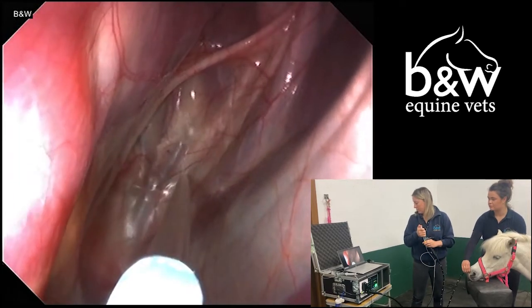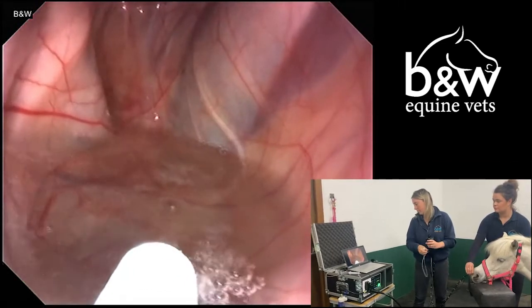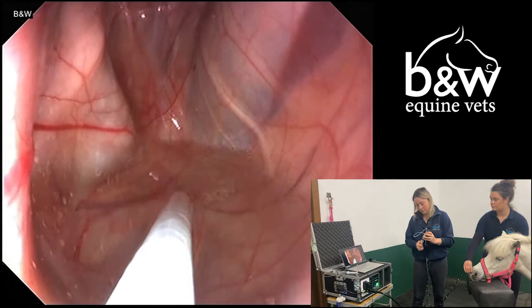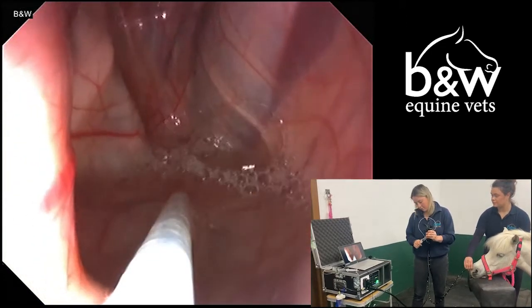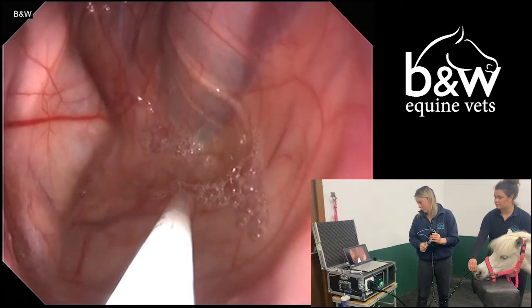We will now instill a small volume of sterile saline into the pouch, which we will then use to wash the pouch and assess for the presence of any small bacteria which we cannot see with the naked eye. Using the endoscope, we can aspirate the fluid back out and collect our sample, which is then sent to the laboratory for analysis to test for the presence of any DNA of the strangles bacteria.